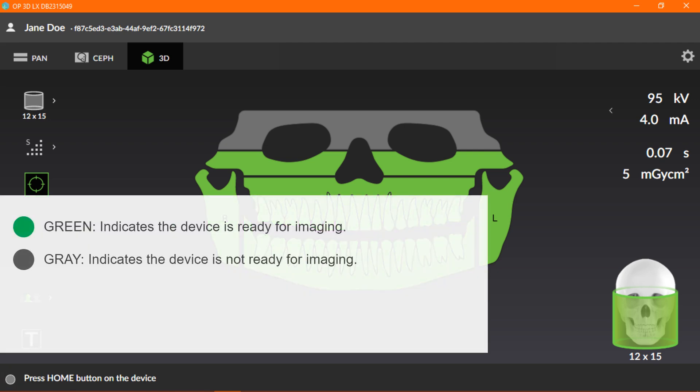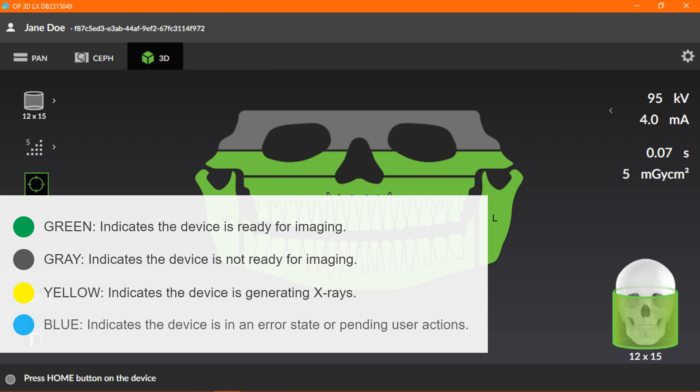Gray indicates the device is not ready for imaging, and you should follow the instructions on the status message bar. Yellow indicates the device is generating x-rays. And blue indicates the device is in an error state or pending user actions, and details will be shown on the status message bar. Now that we've described how to prepare the GUI, let's move on to the next section in this course.